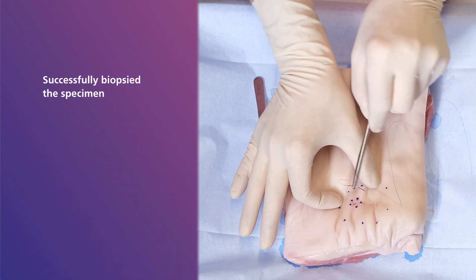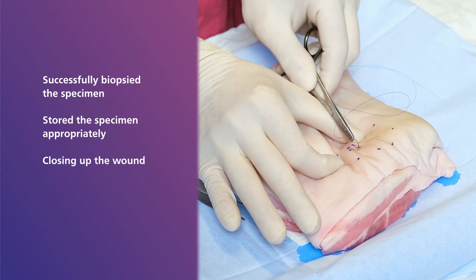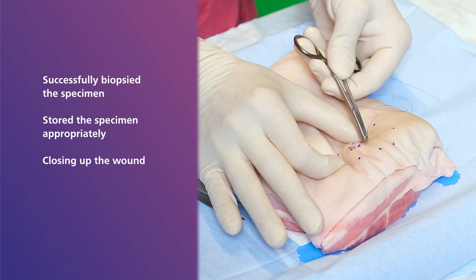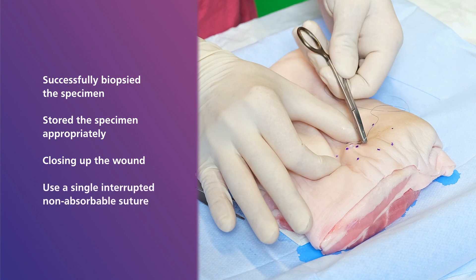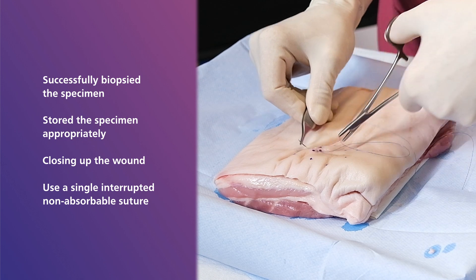Once you have successfully biopsied the specimen and stored it appropriately, it is time to close up the wound. To do this, use a single, interrupted, non-absorbable suture, as can be seen here.